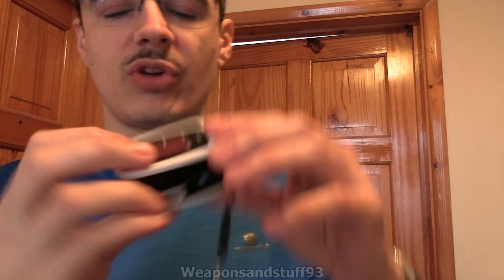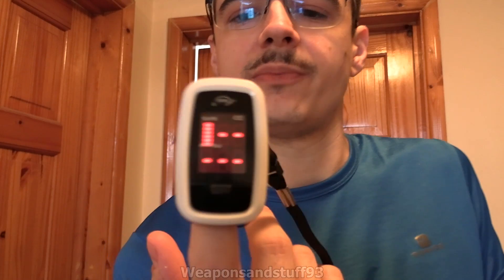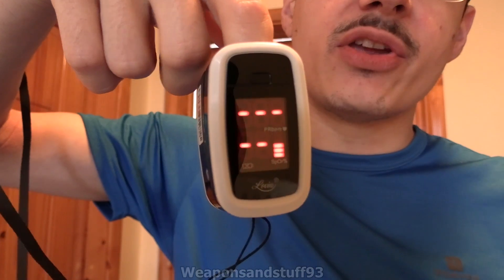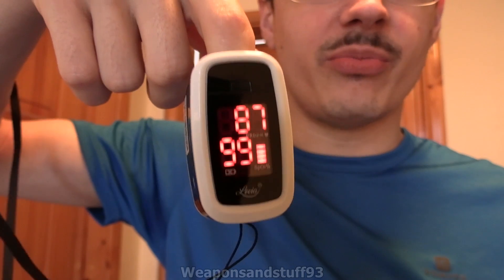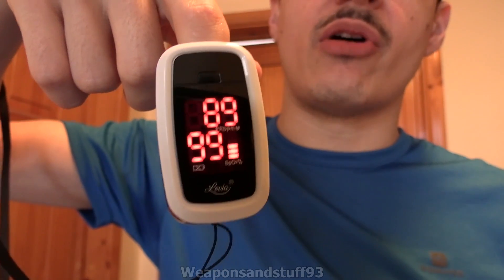These are very easy to use. Most of them — different brands are done in a different way — but you have an on/off button. You turn it on, you open it up, you put your finger inside. In a little minute I'll take a reading. On this one, the bottom number you will see will be my blood oxygen. So that's 99 — that's very good. It was 97, 98 yesterday, so that's improved since yesterday at least. The top number is my heartbeat; that will go up and down a bit.